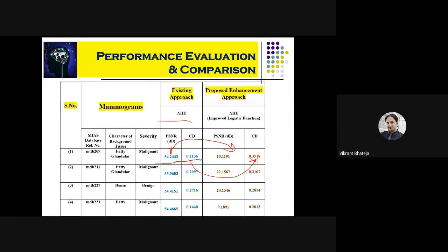So now again something is wrong. You see, the images are very, very well tuned. The functions are tuned. The images are visually very clear, but we see that the quality assessment is not giving you good results. So certainly, this problem was done by my scholar, and it took us a lot of time to reconfigure and find out what problem was actually coming over here.